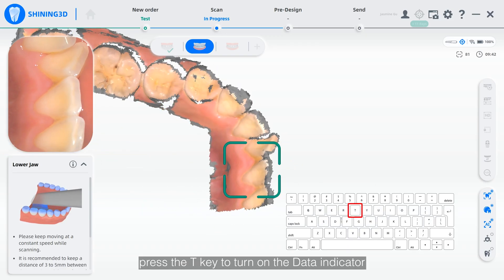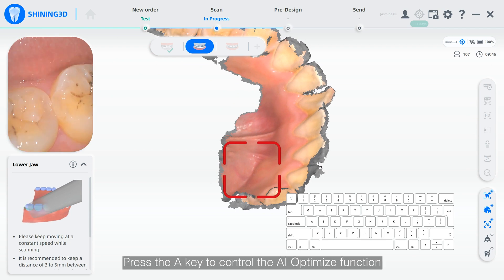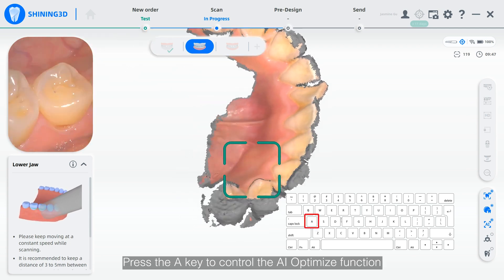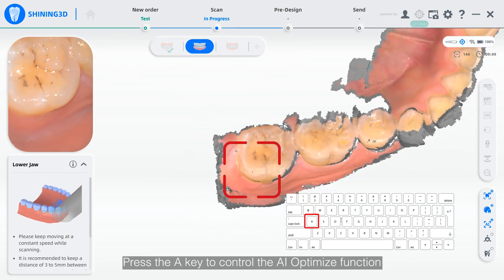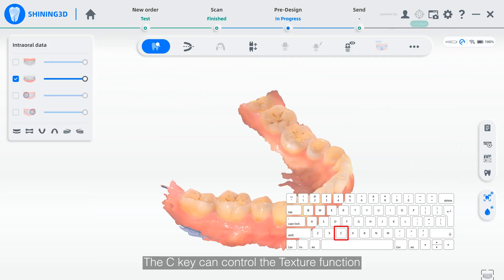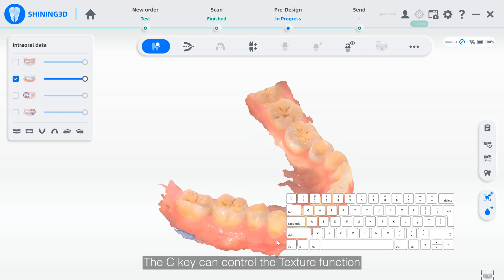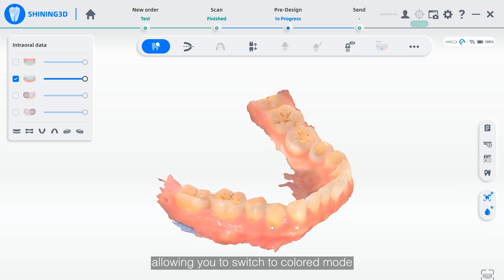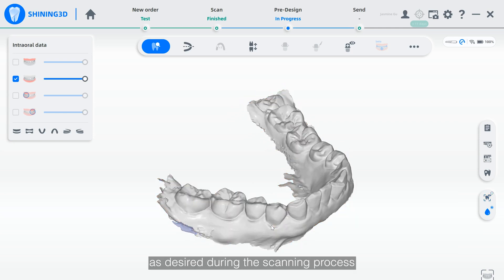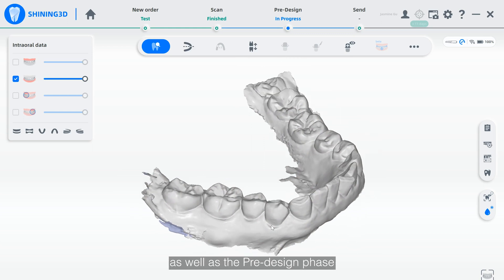During the scanning process, press the T key to turn on the data indicator. Press the A key to control the AI optimization function. The C key can control the texture function, allowing you to switch to a colored model as desired during the scanning process as well as the pre-design phase.